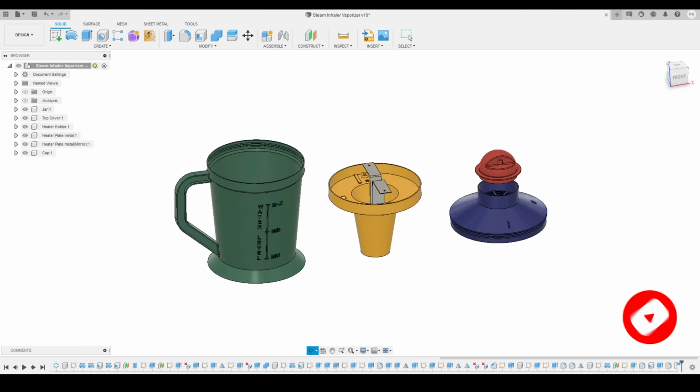Now I will define the dimension using the dimension tool. So this one is 50 millimeters. So here you can see I had just defined 50, and this one is 10 millimeters. So you can see this sketch is not looking as good as our reference image, but still this is the right measurement because I had the product with me and I am measuring and reverse engineering this complete product. So here you can see this alignment is also 2 millimeters.